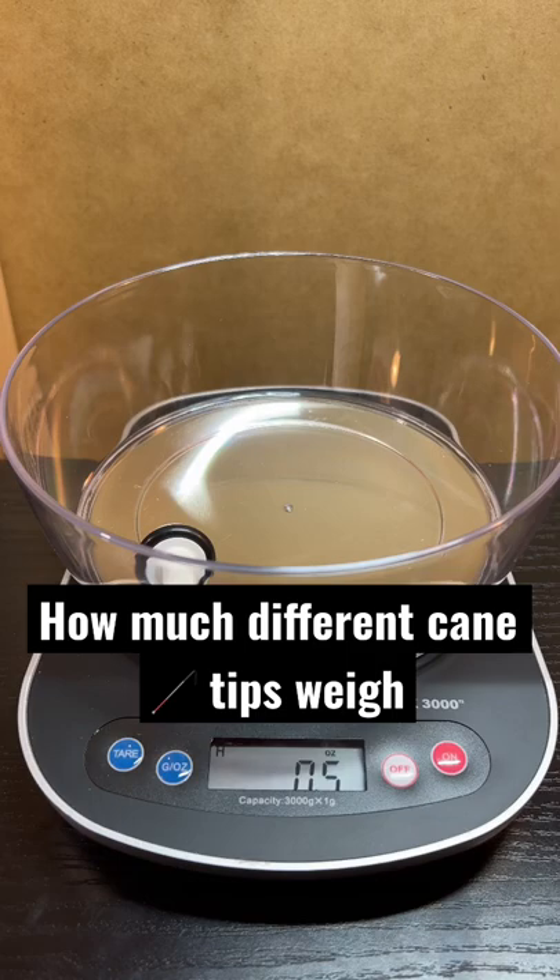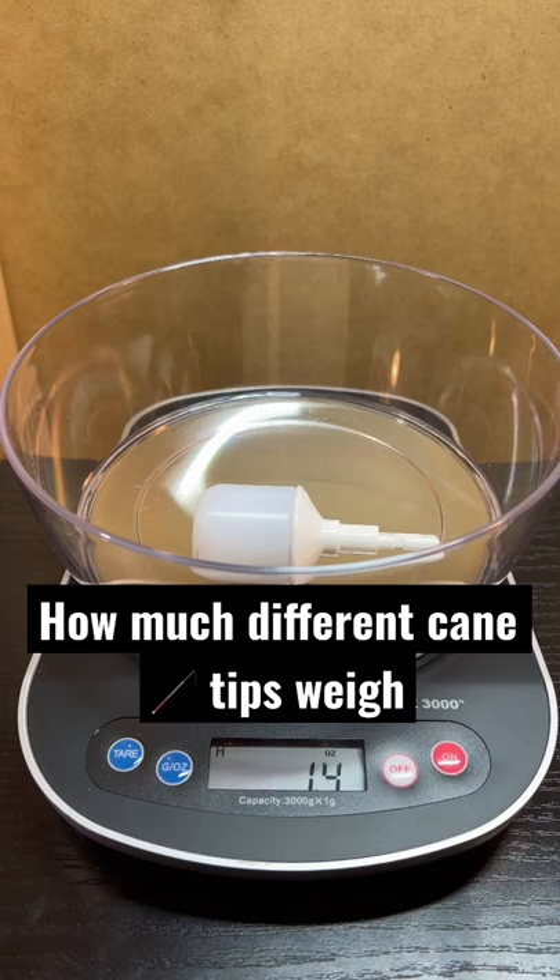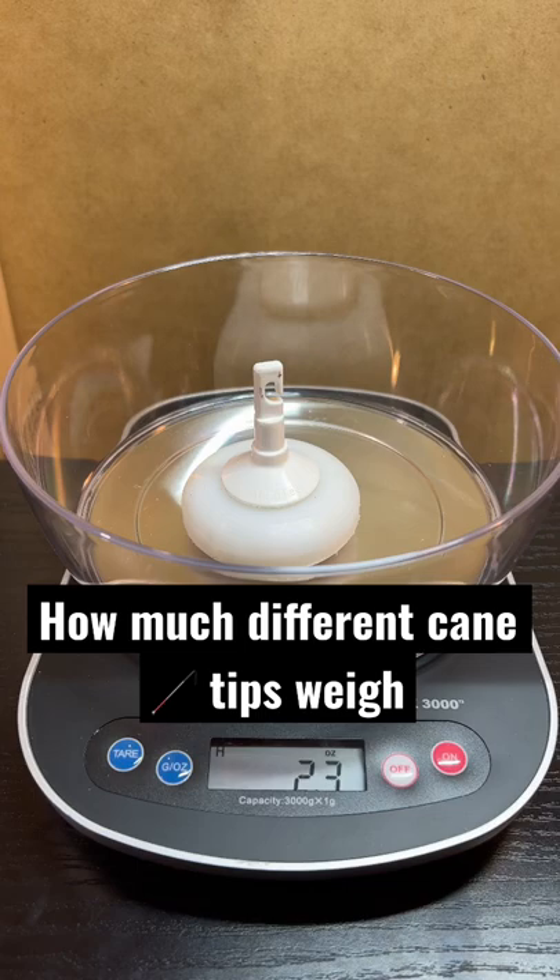This is a marshmallow roller cane tip, 1.4 oz. This is a jumbo roller cane tip, 2.3 oz. This is a rover freewheeling cane tip, 1.7 oz.